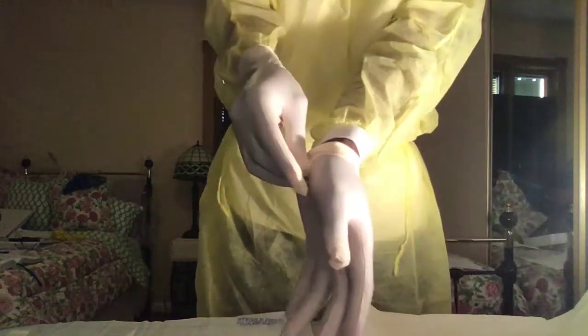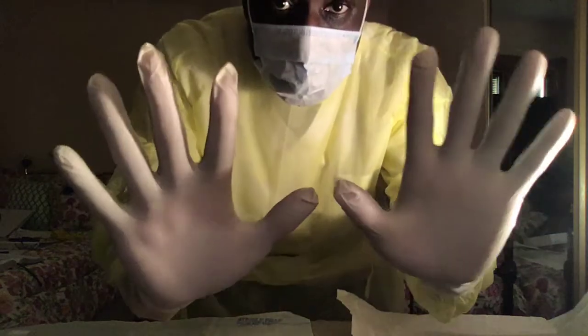Also want to put on my gloves. I'll use the outer edges. I have my gloves on.